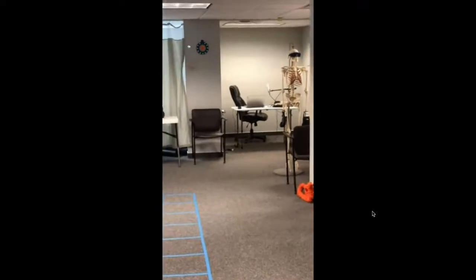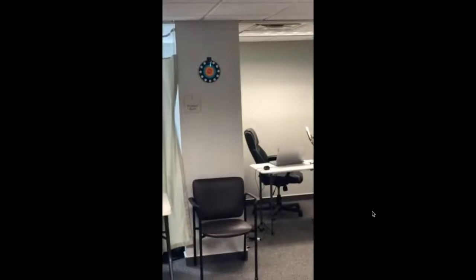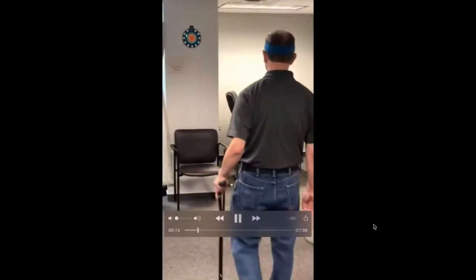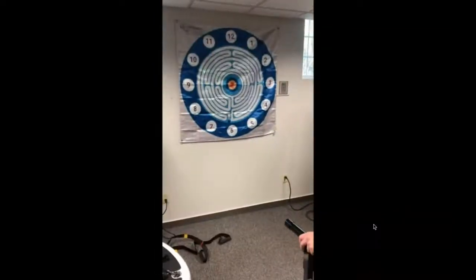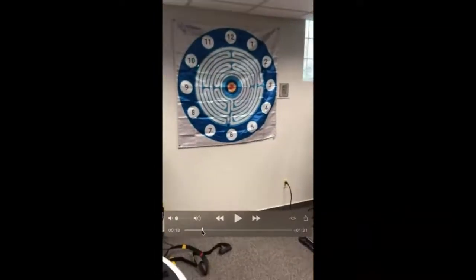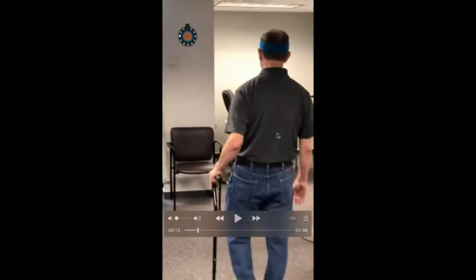He's going back and forth between two targets for some motor control applications. There's a huge postural component as soon as they turned on the laser and they wanted to keep, during his walking, keep the laser on the target. Let me go back just a second. His posture, his upright posture changes.